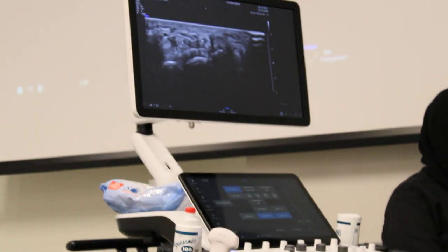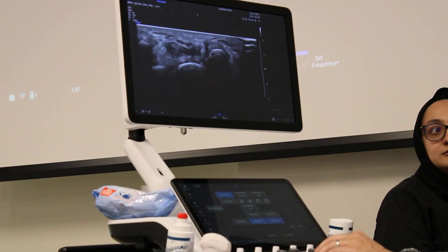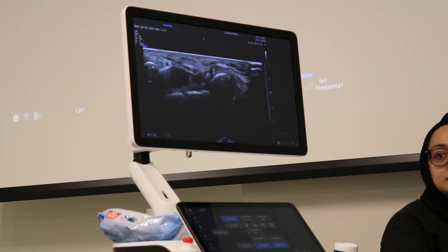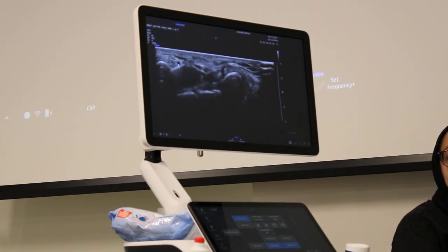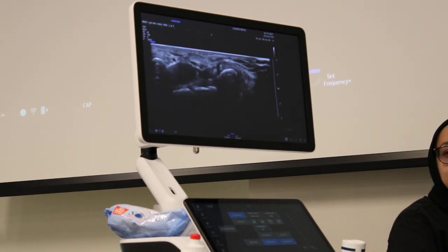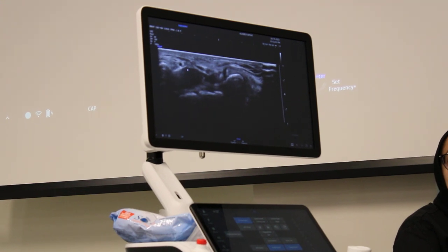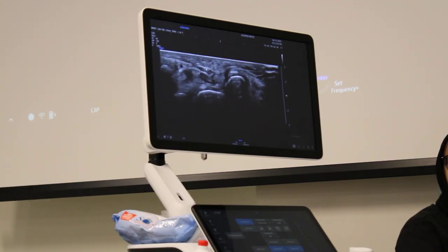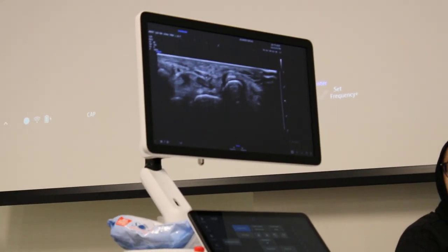So just so everyone here knows — this is her bone on one side of her wrist. This is her artery. This is the nerve here. And then you can actually see this is the median nerve that gets swollen.